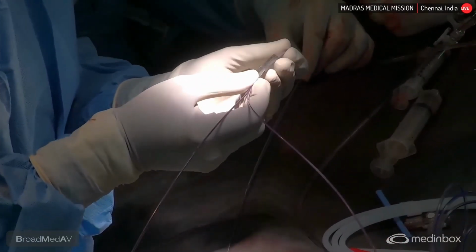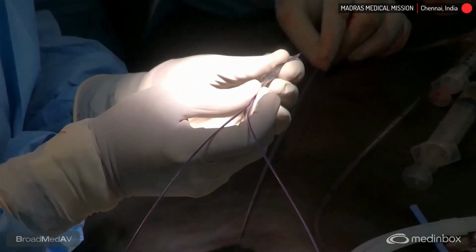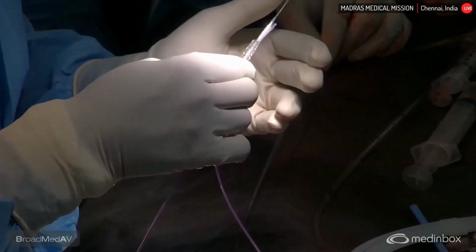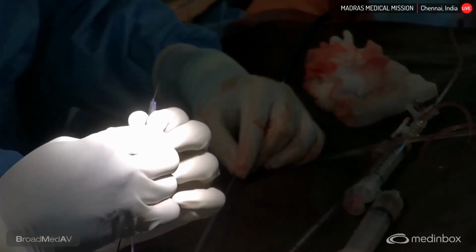So now we are centering the two balloons and then keeping the stent in the middle.